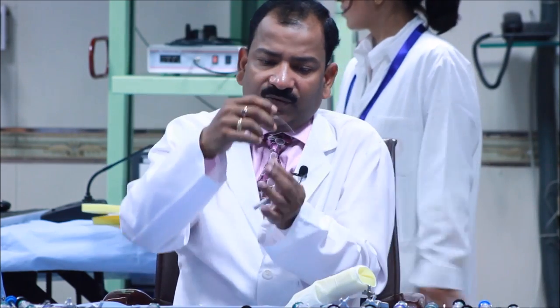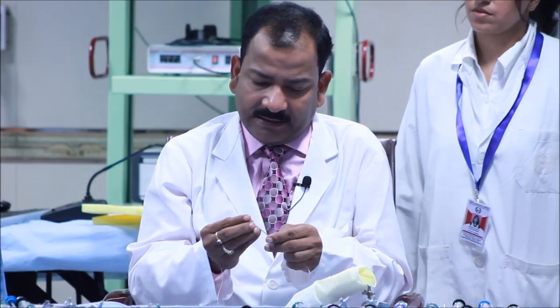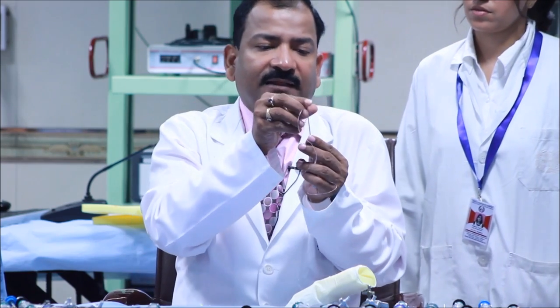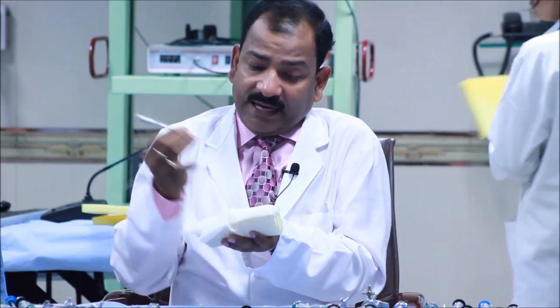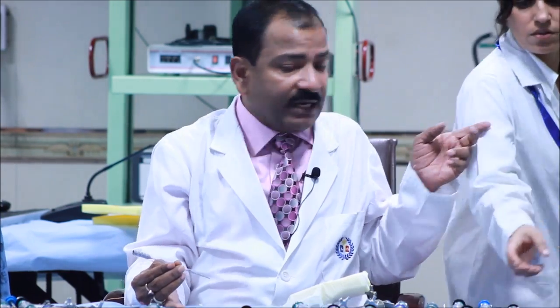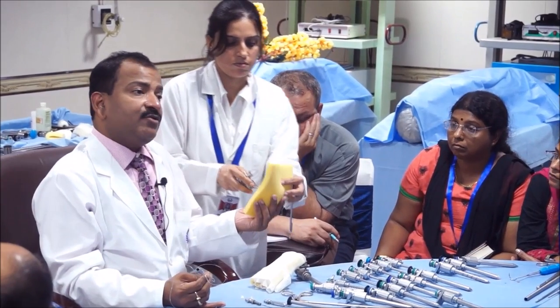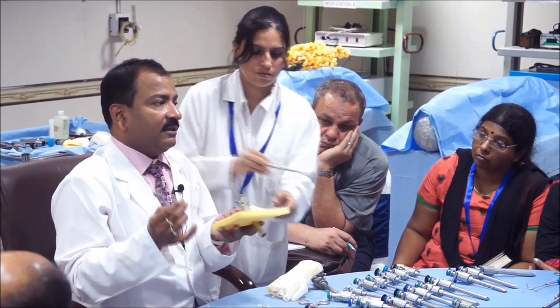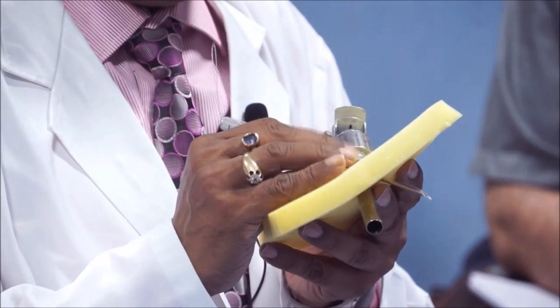You make a loop first like that and then put one suture, and put 2 centimeters of this suture only inside this eye like that. That's all. And then hold it this way. And even if the cannula is there, put it in the cannula, put the trocar in it, and go through the same abdominal wall. Even if the trocar is there, you can close it. Go by the side and then introduce it in.